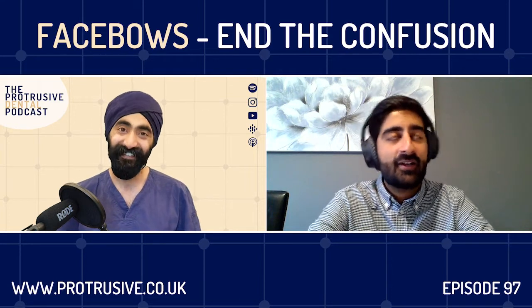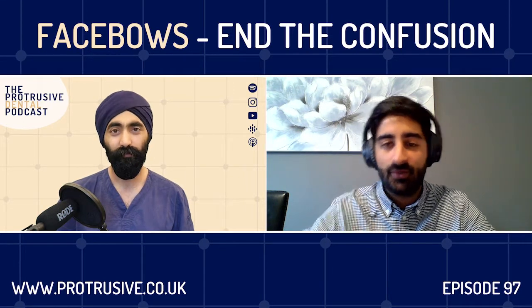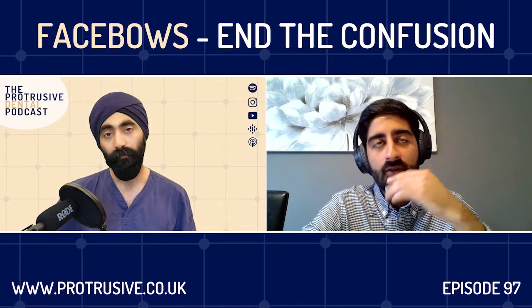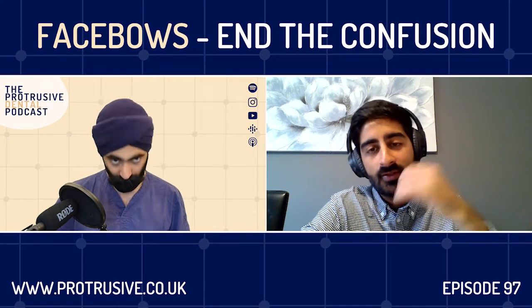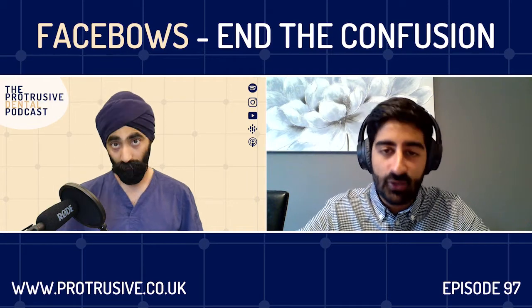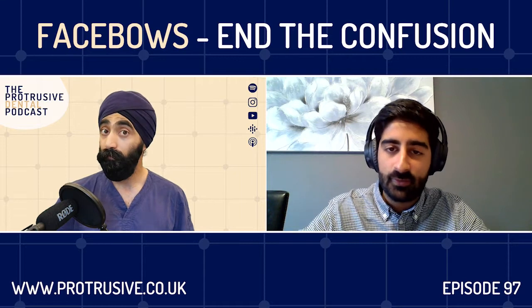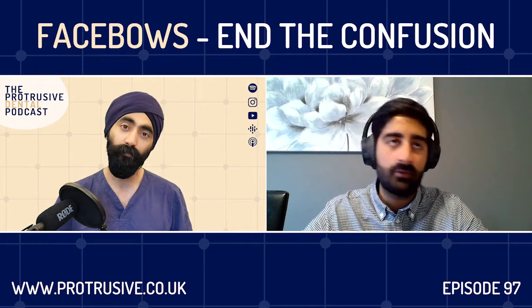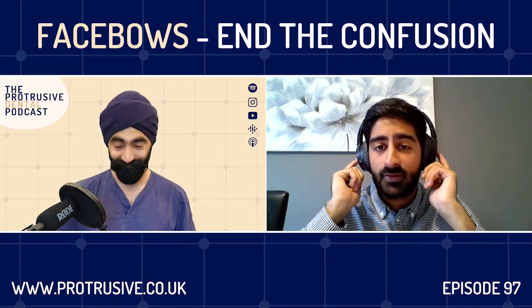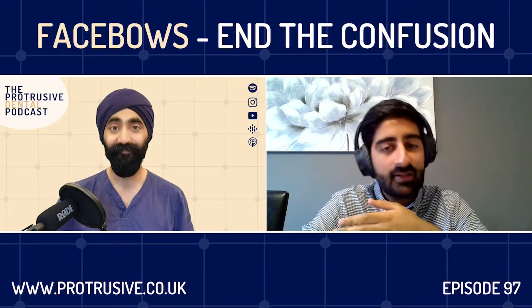It creates so many random thoughts and mysteries that I didn't understand it at all until I got to the Eastman Dental Hospital. So the Facebow is purely just a way of measuring the relationship between the teeth to your jaw joints. It's just a utensil that we use. Now the reasons why we would use a Facebow, there's aesthetic reasons and there's functional reasons. The aesthetic reason would be to translate a patient's cant to the lab, but that's definitely not the primary reason, because the Facebows that we use are arbitrary Facebows, which means we use the ears as our reference points, and people's ears are not necessarily parallel to the interpupillary line or to the floor, but they are in the majority of patients.